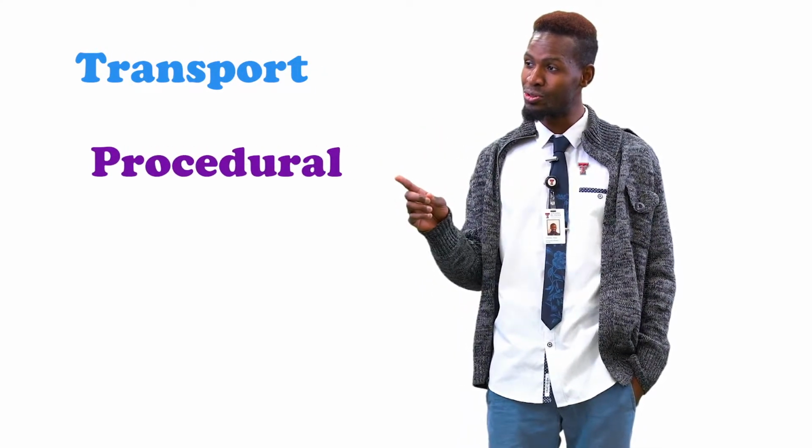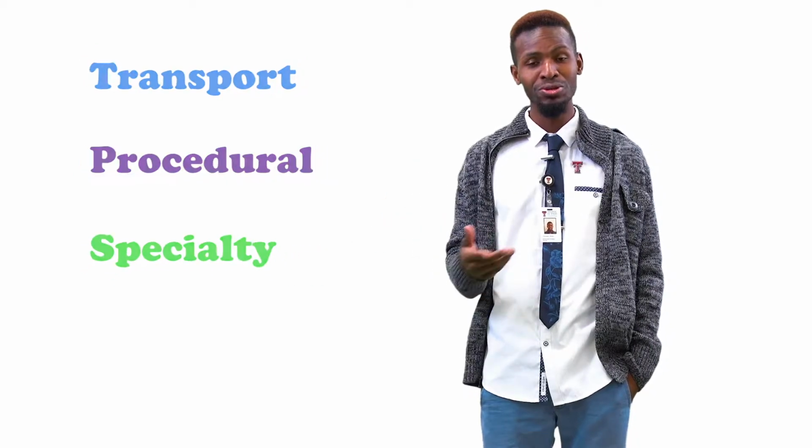Hi, my name is Chris, and today I am going to inform you all on how to properly use transport, procedural, and specialty stretchers.